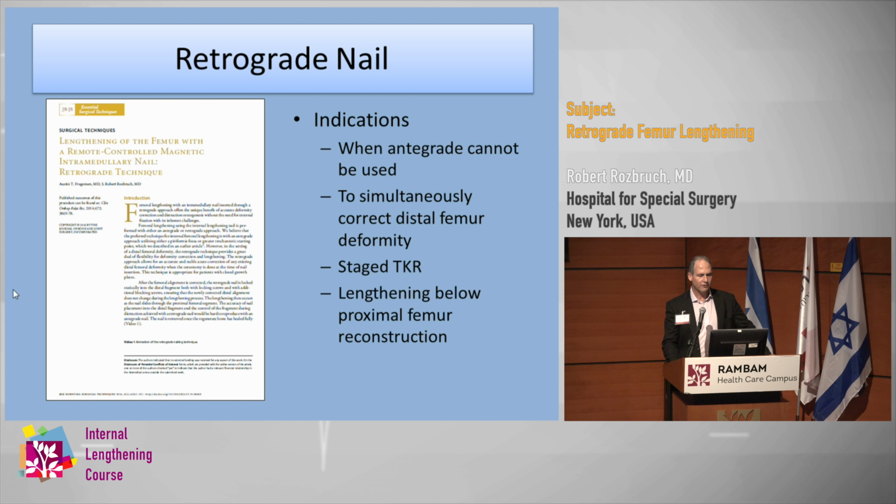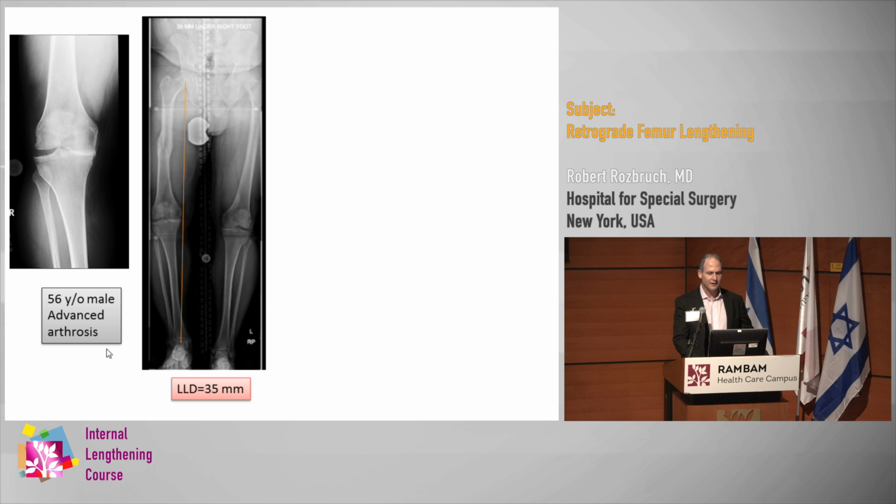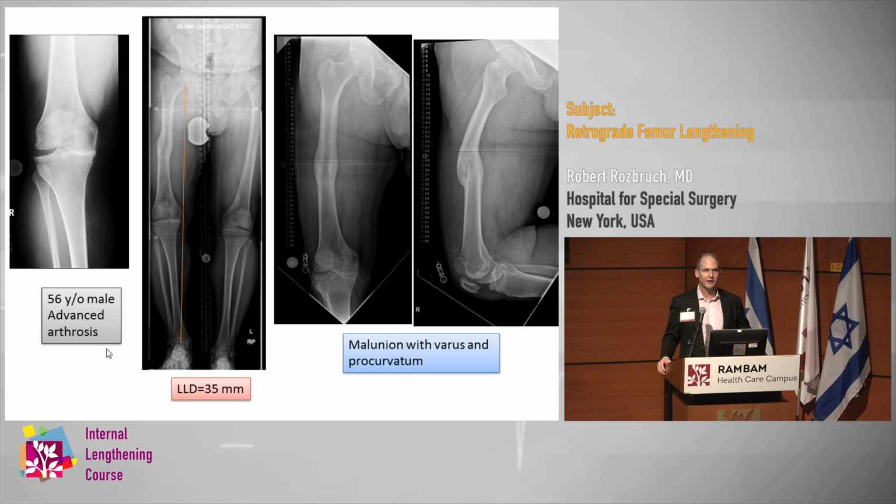This is an article in JBJS Surgical Techniques on the retrograde technique, which you may find helpful. So here's an example of a patient who was sent to me by one of my arthroplasty colleagues at the hospital, and you can see he's got advanced arthritis of the knee, but he also has a leg length discrepancy of 35 millimeters, and there's also some sagittal plane deformity that was felt to be necessary to correct.